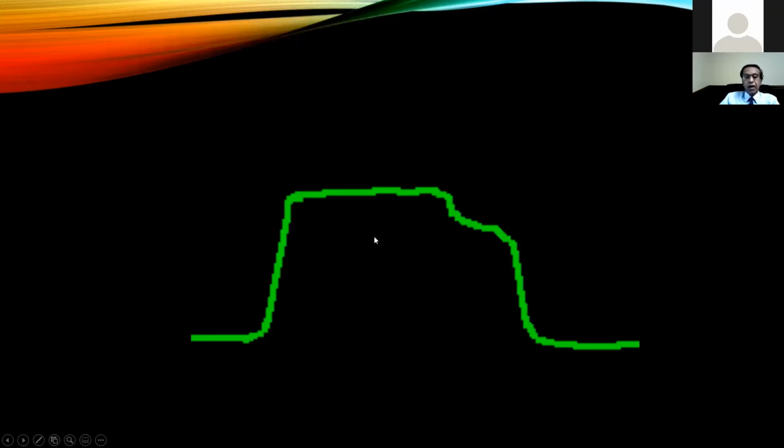Now, this is a capnogram where you can see this is the expiratory plateau and there is a sudden dip. This is because of the forward flow during inspiration from the ventilator, which is diluting the expired gases. So the expiration probably must have ended here. This is the expiratory plateau, or the expiratory pause, during which time it is diluted by the forward flow during the next inspiration, giving rise to this variety of capnogram.